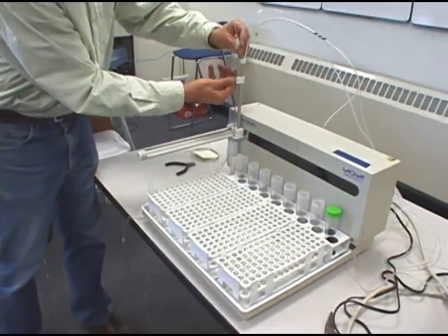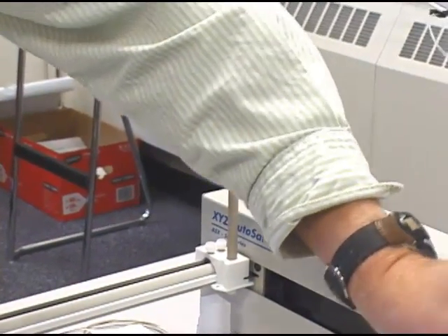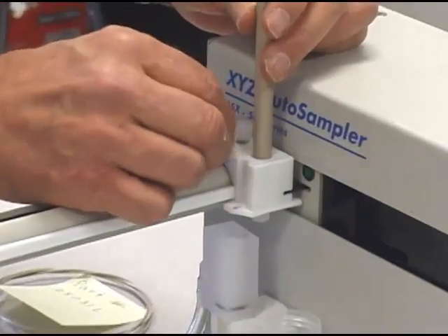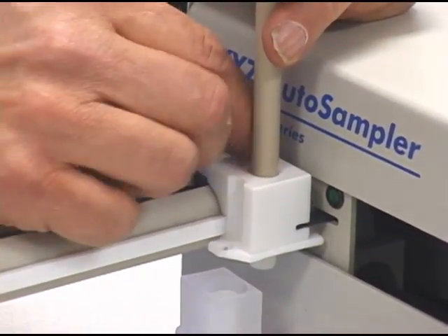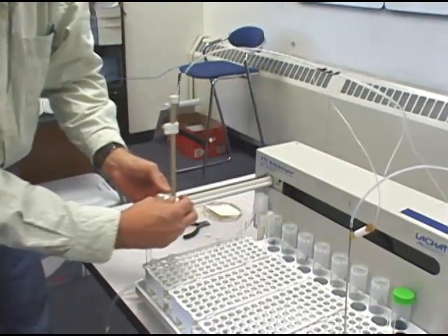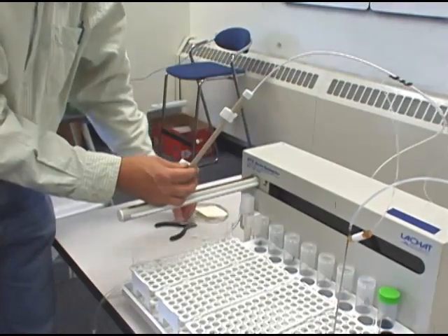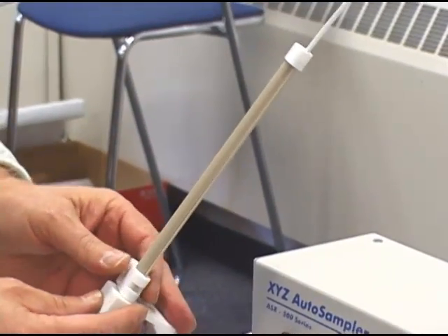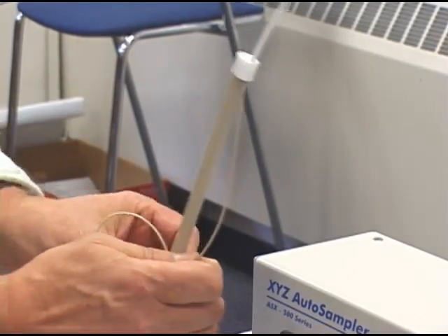What we'll do here is remove the probe and set it aside, and also remove the Z-Arm mount. Pull that off — make sure you don't lose that screw that holds on the probe. Pull the slide all the way down to the bottom, and now we should be able to pull that peak tubing from the sleeve.